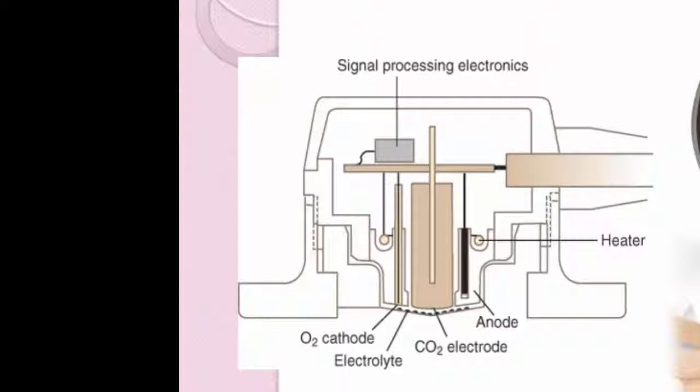You put it on there and you actually place the electrode on the gel, and then you tape the electrode down, and it provides for better measuring, better contact. Without that gel, you don't get good readings at all. But that's what this is, and you see it's got that heater on there, again to about 42 degrees Celsius. So you have to change this at regular intervals, every 4 to 6 hours, because if you don't, it's going to burn their skin right there if you leave it there all the time. Then they'll have a little burn there that's an additional source for infection to occur.